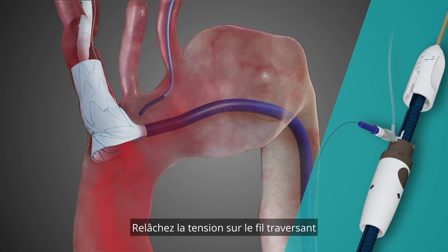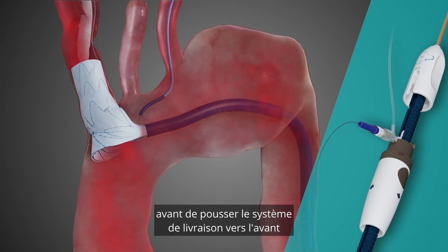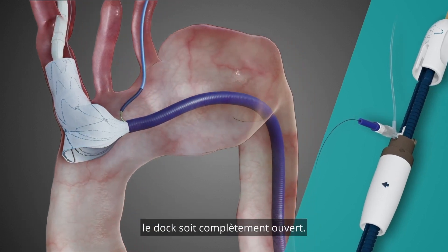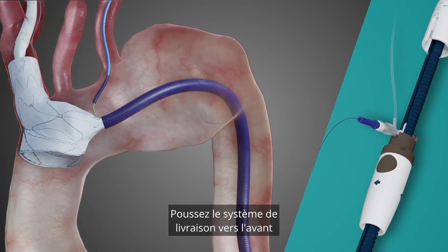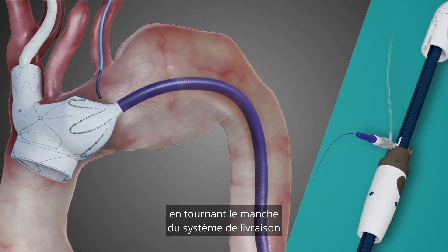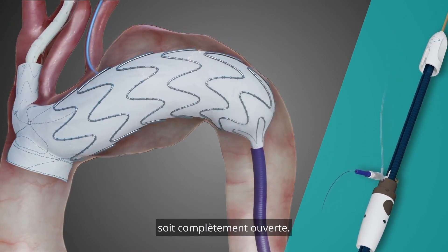Release traction on the through and through wire from the right arm before pushing the delivery system forward to position the dock z-stent against the outer wall of the ascending aorta. Continue to deploy until the dock is fully opened. Push the delivery system forwards a second time to align the dock position to face the ascending aorta. Finish to release the stent graft by rotating the delivery system handle until the distal end is fully opened.